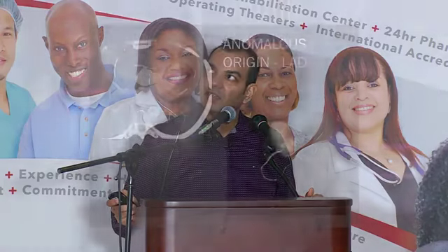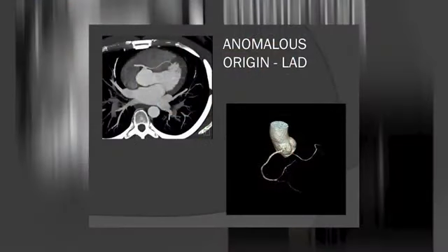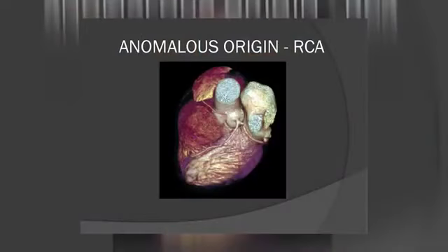So, an example here, anomalous origin of the right coronary artery. If you see here, this RCA is actually originating from the left cusp. The LAD is originating from the left cusp. So it should have come off here, but it is coming off here. This is an anomalous origin, a fairly common variant. Reconstructed images showing the RCA here and the LAD here, coming off from the same cusp.